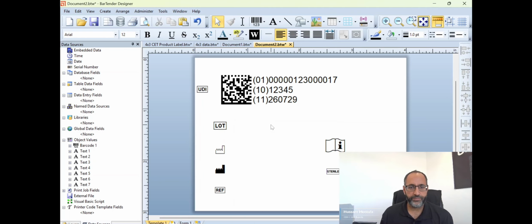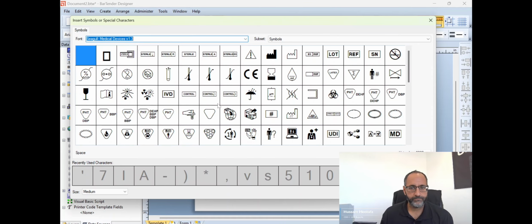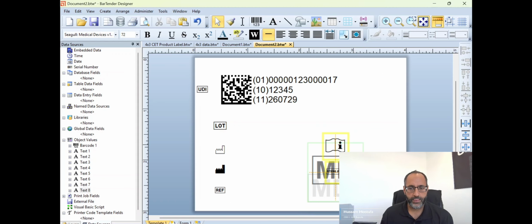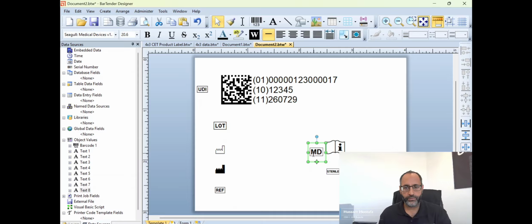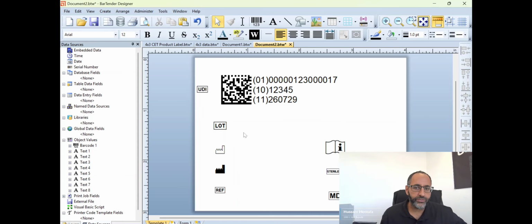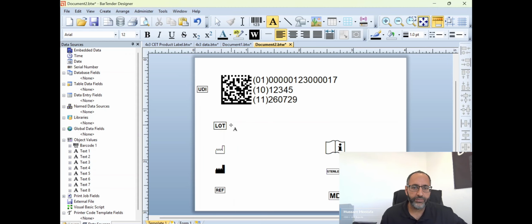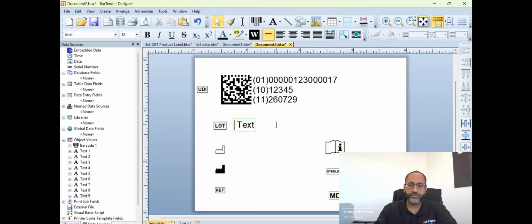Okay. Let's grab the medical device symbol. Okay. So now, go ahead and grab this, bring it down. All right. We could add some information in here. So let's just go ahead and start putting some information in. Let's go ahead and do the normal text. So for lot, we can go ahead and put some text in there. Let's make sure the lot matches what we have next to the 2D data matrix. So let's just delete this, delete that. So we can just put 1, 2, 3, 4, 5 as a lot information.